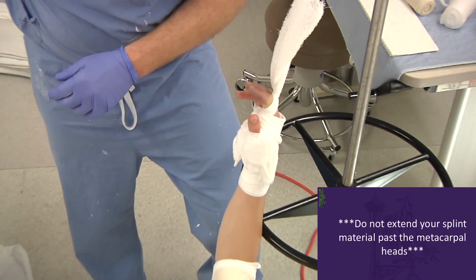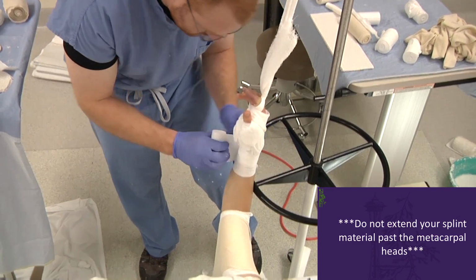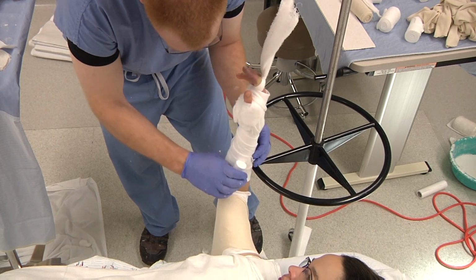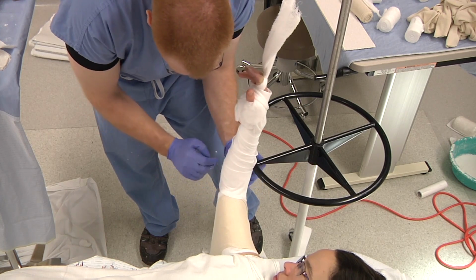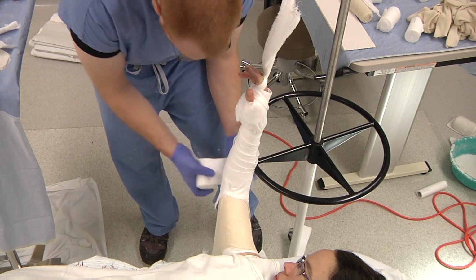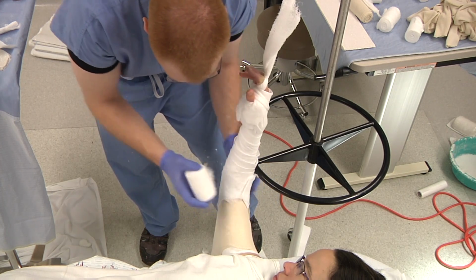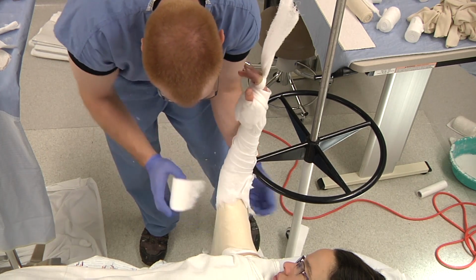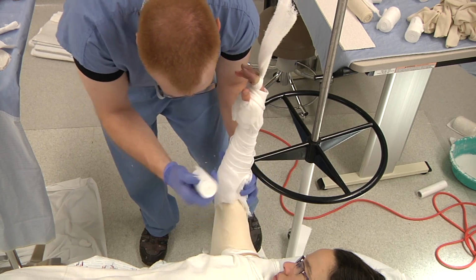From there, it's easy to continue down the arm, minimum of 2 layers. You get to the elbow. You do have your medial and lateral epicondyles, which are at risk for pressure, as they are bony prominences, as well as your olecranon process. So pay special attention to those areas and pad them adequately.